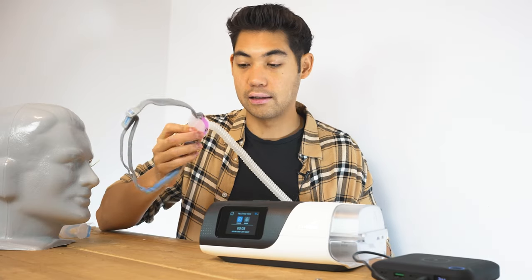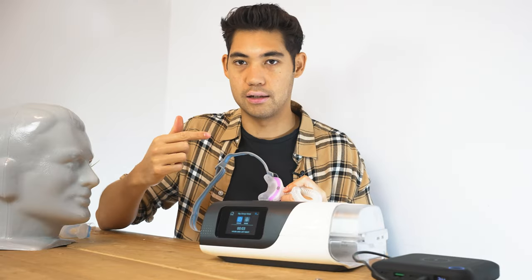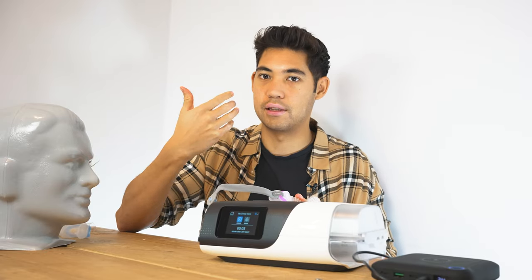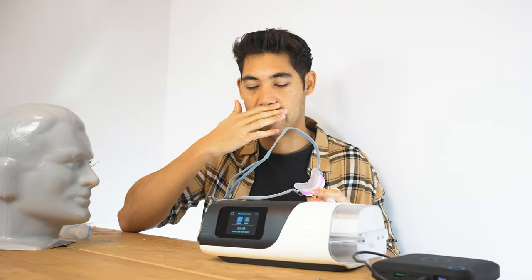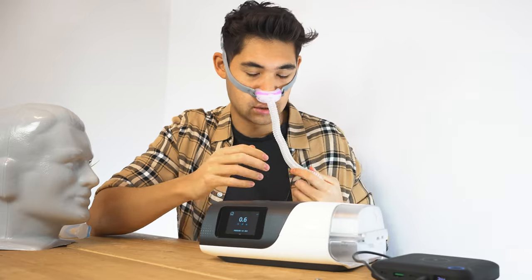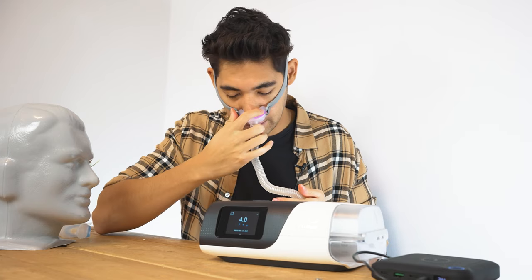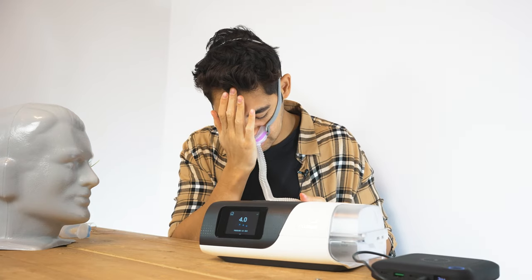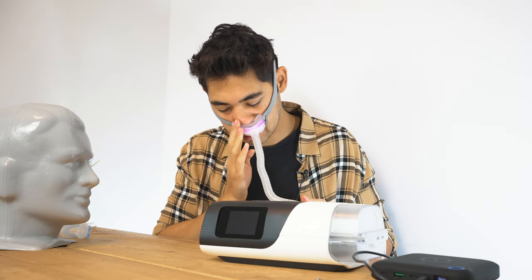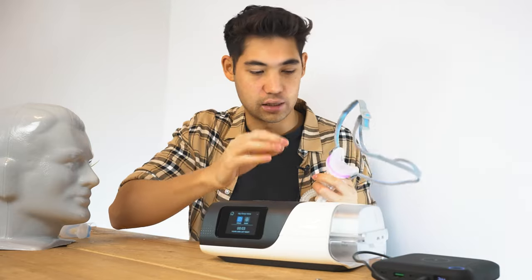The one thing I don't like about this mask is that compared to the P10, I find the cradle has a higher tendency to leak than the pillows. This is because pillows go around the inside of the nostril, whereas cradles are just sitting under the nose. With this mask, if your sleeping pillow is pushing it a little bit, you can hear that leak — whereas the pillow mask doesn't leak as much.